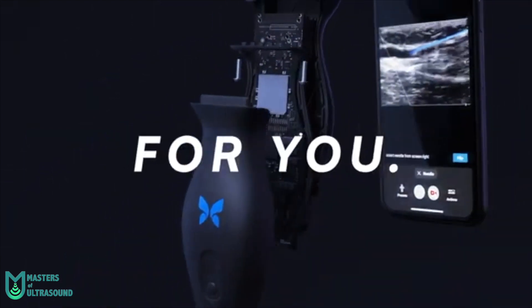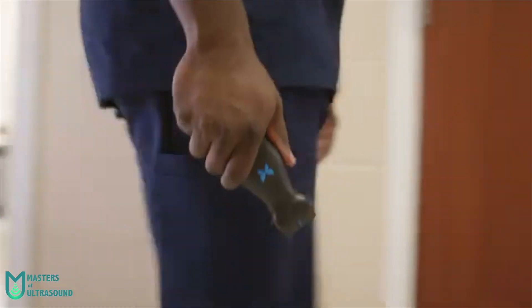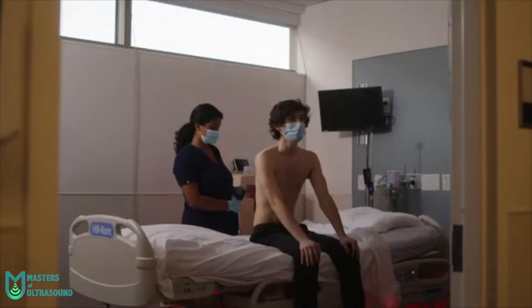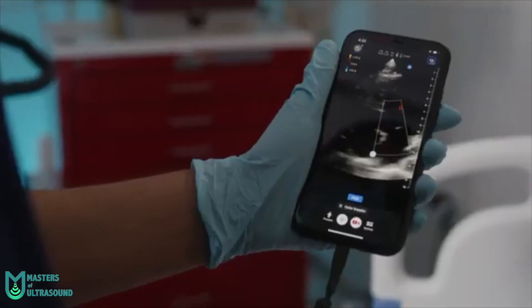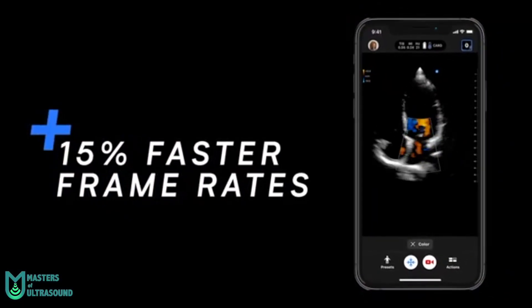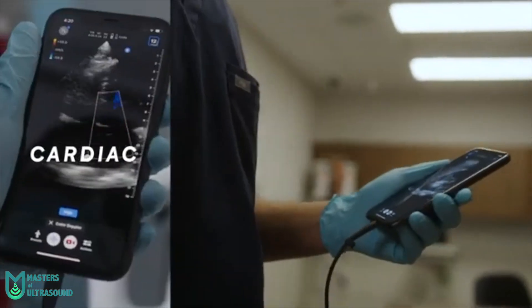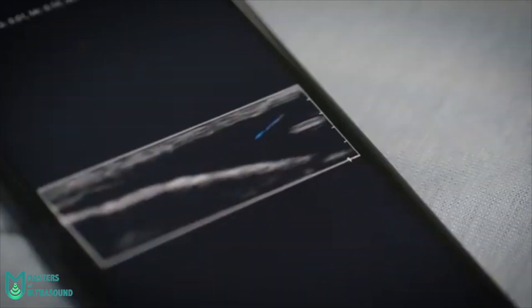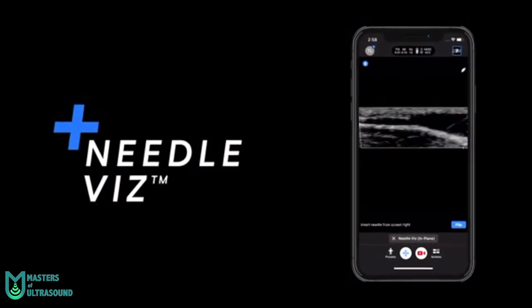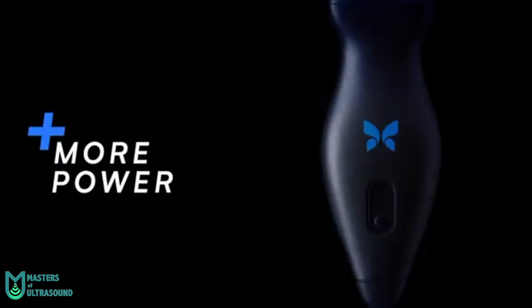I also use it for echo-guided procedures like thoracocentesis or paracentesis. It is practically immediate from the moment you connect it to your mobile or tablet and start performing the ultrasound. Both lightning and USB-C connectors allow you to connect it to any iOS or Android device. Point of care ultrasound — POCUS — has come to change our daily clinical practice and to allow us to make faster and more reliable decisions in first-level centers and also in centers with fewer resources.